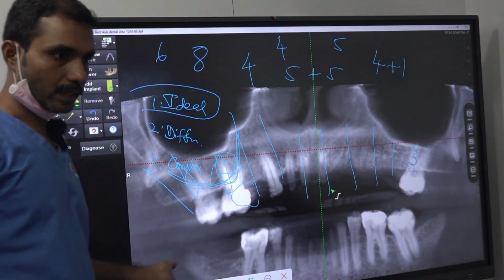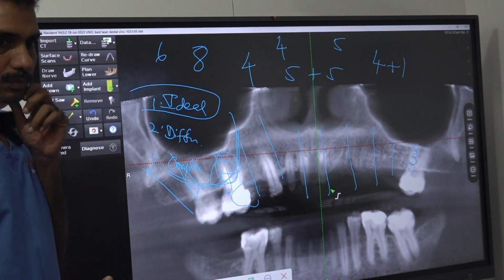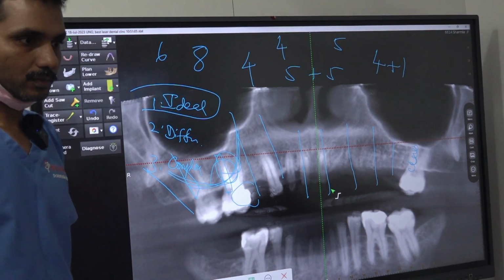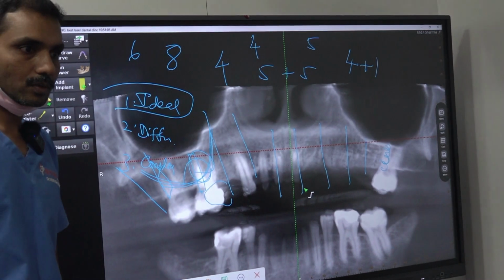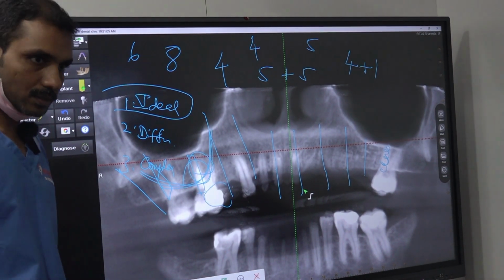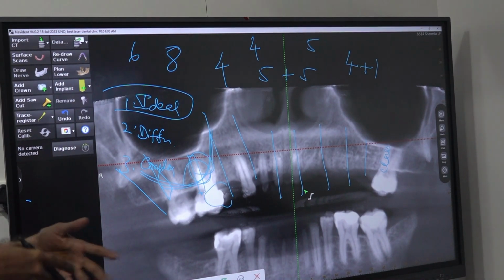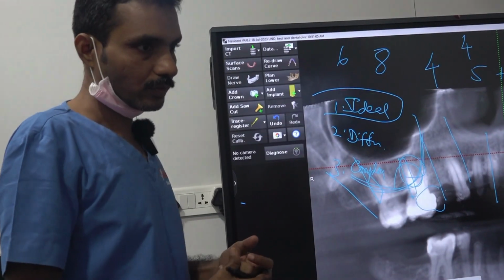Considering she is young, she must be below 40 years. Next 40 years, she may live possibly. So till that 40 years, she has to take up the load. So don't compromise on the number of implants. Okay. So that is why it is better to always tell the package. So whatever implant is necessary, you put it. Don't try to save money on the number of implants.